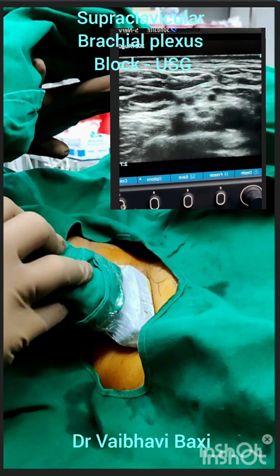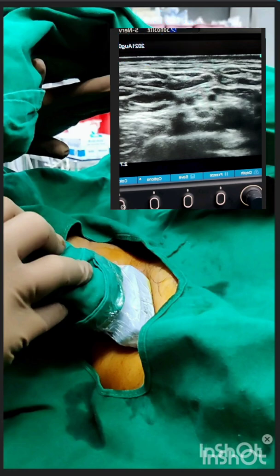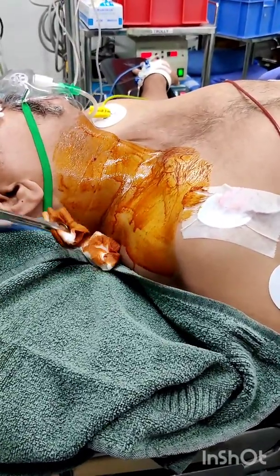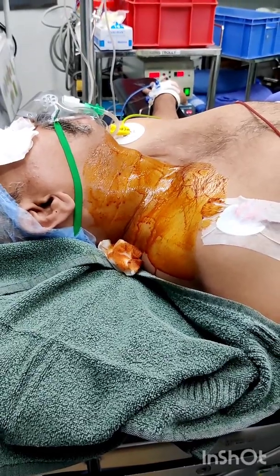Supraclavicular brachial plexus block is indicated for surgery distal to mid-humerus, elbow, forearm, wrist and hand. This patient is posted for right hand surgery. IV access was achieved and standard minimal monitoring was applied.